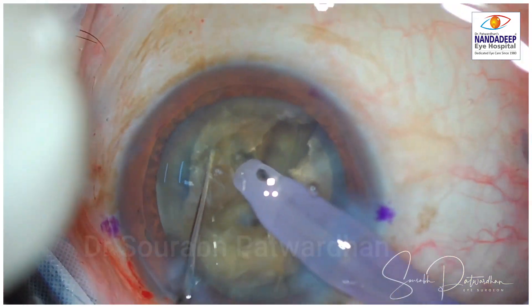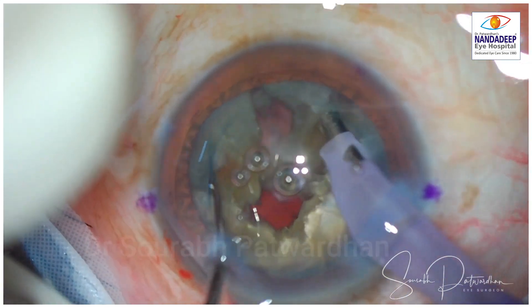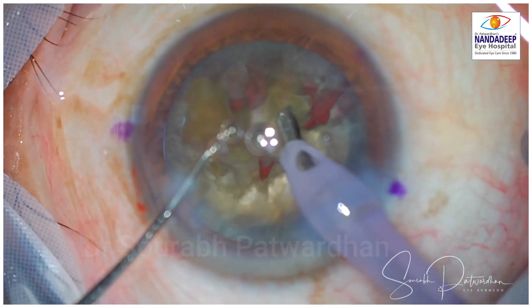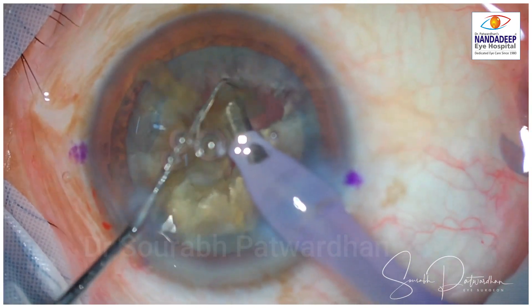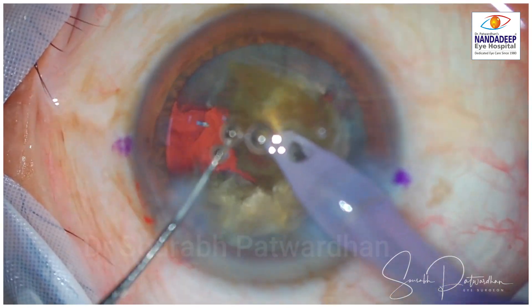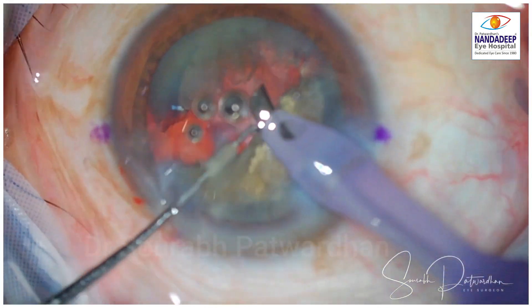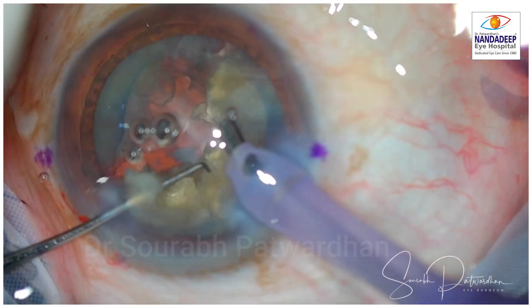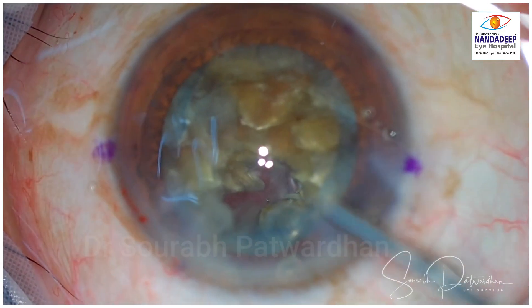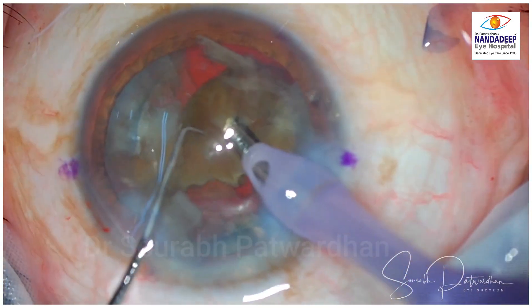You can see the chopping using a 1 mm Sinski chopper till the posterior plate. Once 7 to 8 pieces are made, I have shifted to quadrant removal. The phaco tip goes sideways so I can remove these pieces quickly. I am using ozil with IP — Intelligent Phaco — so whenever there is occlusion, there are a few pulses of longitudinal phaco to avoid any blockage of the tip. In between, I replenish the dispersive OVD followed by methylcellulose in the back, which will prevent any chance of endothelial damage and keep the cornea crystal clear immediately postoperatively.